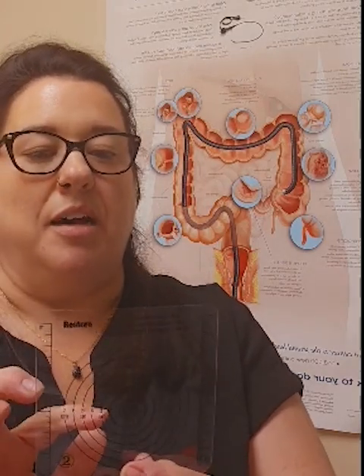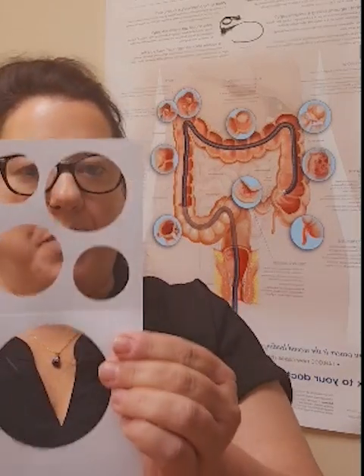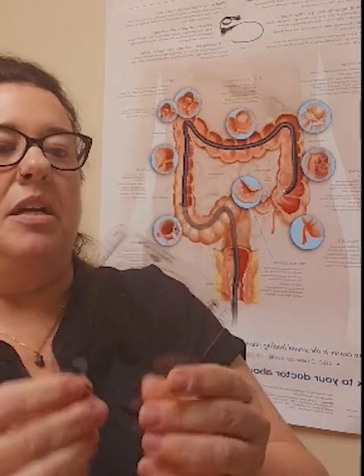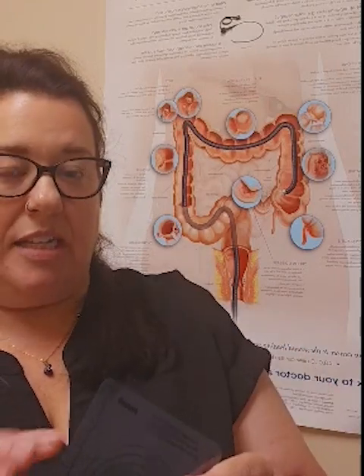And then you can use this, as I said, as a template, or any of these as a template, but measuring with the ruler that's on the side of this, across the stoma and up and down the stoma, will help give an indication that it's going down in size as it should post-surgery.